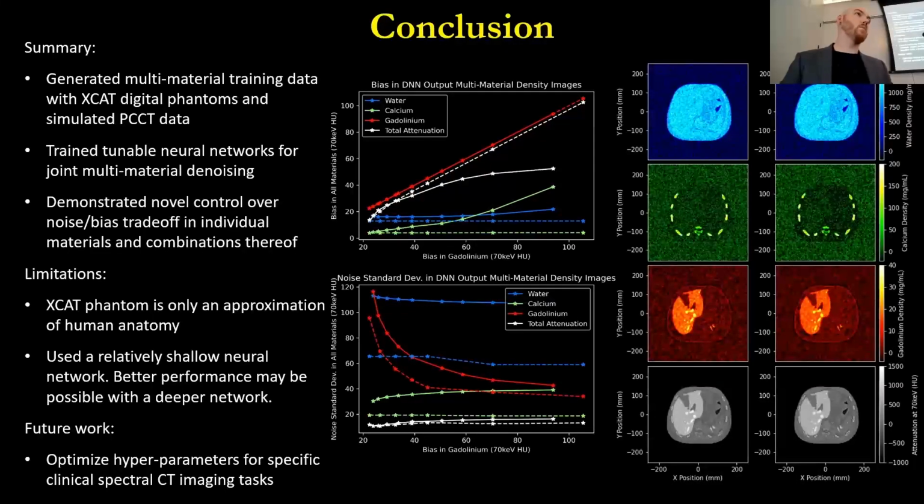So maybe one solution around it would be to do what people do today. They do a frequency split. So basically, you do a reconstruction with your ML algorithm or with alpha equals 0, and you get a noisy image without bias, you smooth this image, and then you do the corresponding high pass filter on the other image that has low noise, and then you add these two together, and then you would have an image that has no bias and low noise at least in those lower frequencies that are of interest to do quantitative evaluations. And then you would probably get around choosing alpha and beta. You would set alpha to 1, I guess.